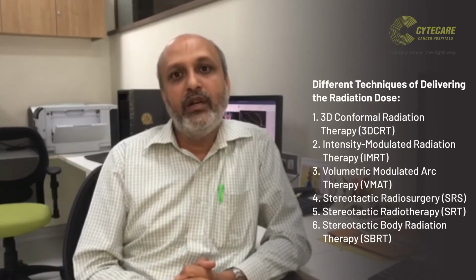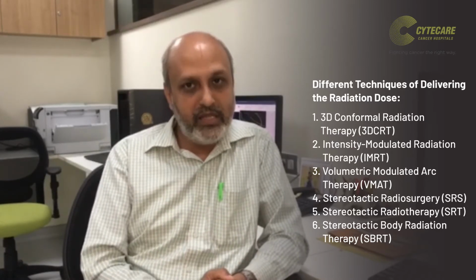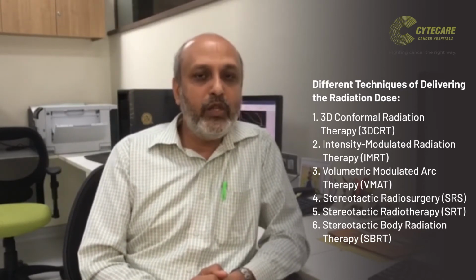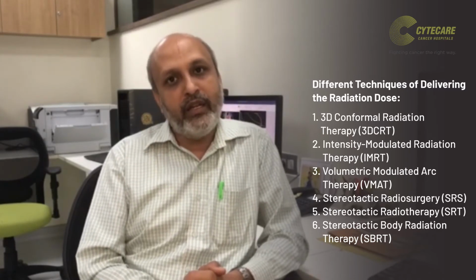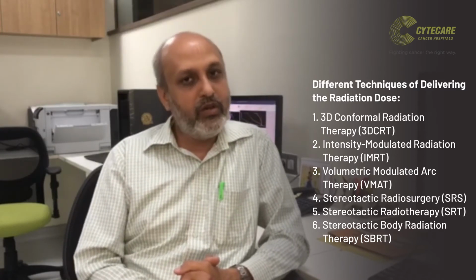Delivering the radiation dose has different techniques by which it can be delivered to the patient. Basically there are 3D conformal radiotherapy, intensity modulated radiotherapy, volumetric modulated arc therapy, stereotactic radiosurgery, stereotactic radiotherapy, and stereotactic body radiation therapy. In short form they are called 3D CRT, IMRT, VMAT, SRS, SRT and SBRT. These techniques will be decided before delivering on the patient, so accordingly the planning techniques will also be different.